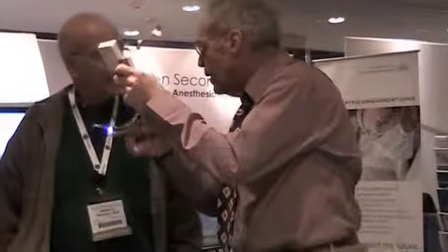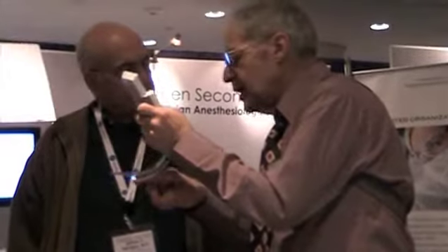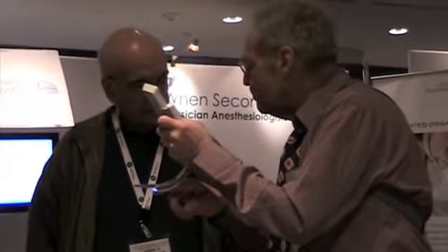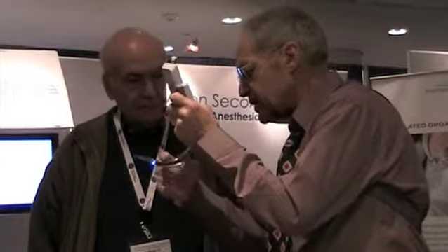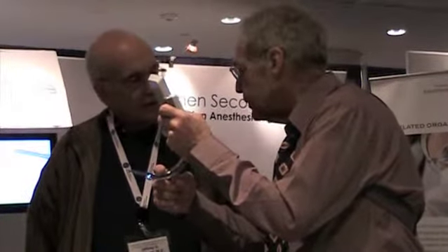It puts the eye right up here. It's a different difficulty of procedure — because you're always past the tongue, so you never have to worry about the tongue.